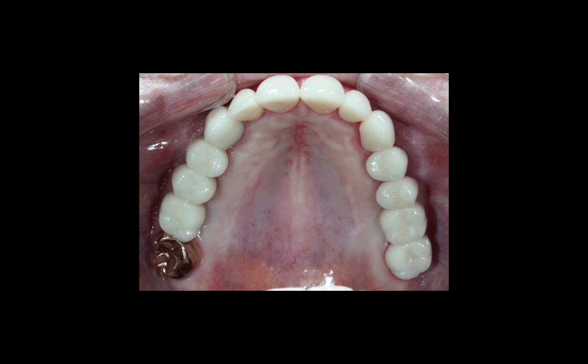This was the occlusal picture of this case. You can tell that there is not much layering, not much different type of characterization. She actually wanted it like that. She wanted white, and that's it. She didn't want any color, anything natural.